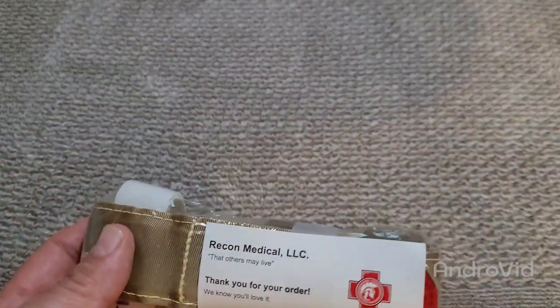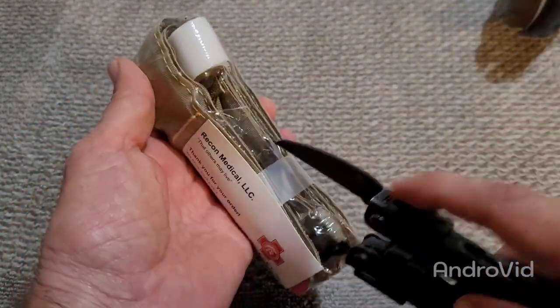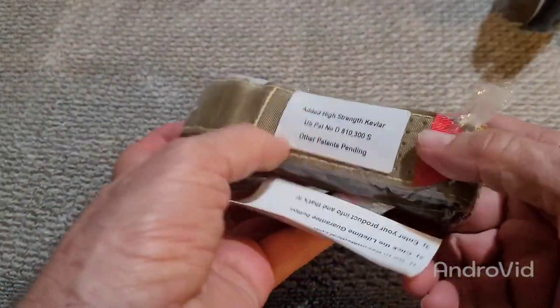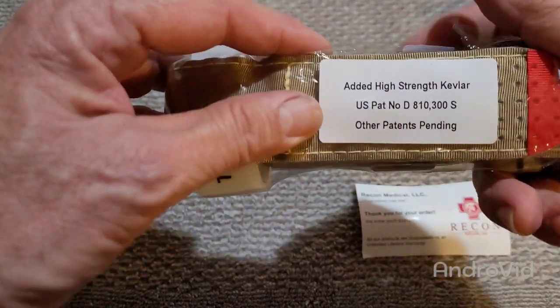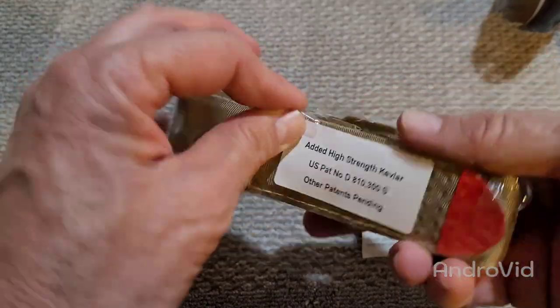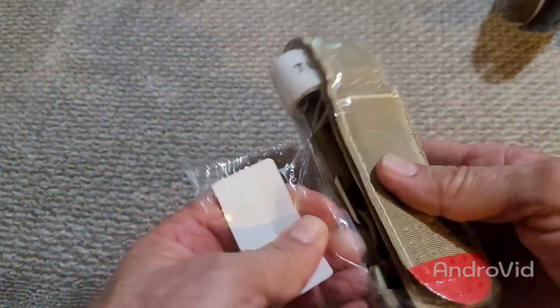First thing I want you all to do is just unwrap it, take it out of the packaging. It's got added high strength Kevlar, US patent. These are pretty good for a budget.